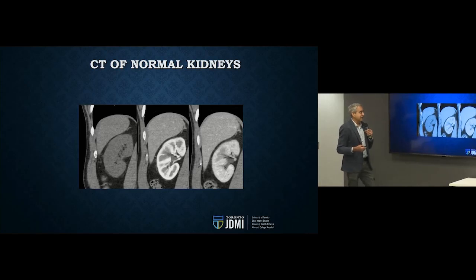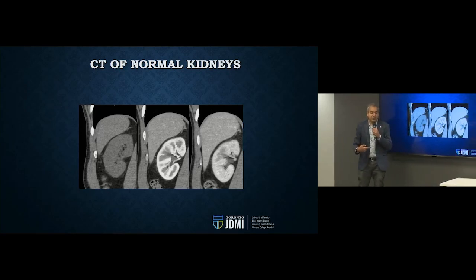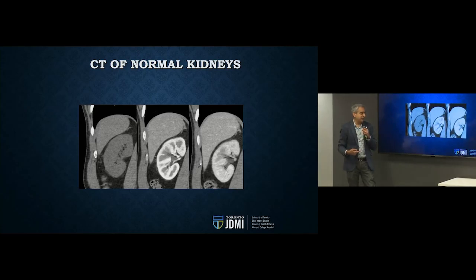And this bolus of contrast, large volume, goes through the cardiovascular system and flows first into the kidney, into the renal cortex. And so we take a picture when we think that that's the usual timing around when the enhancement occurs, or the flow of blood goes into the kidney.